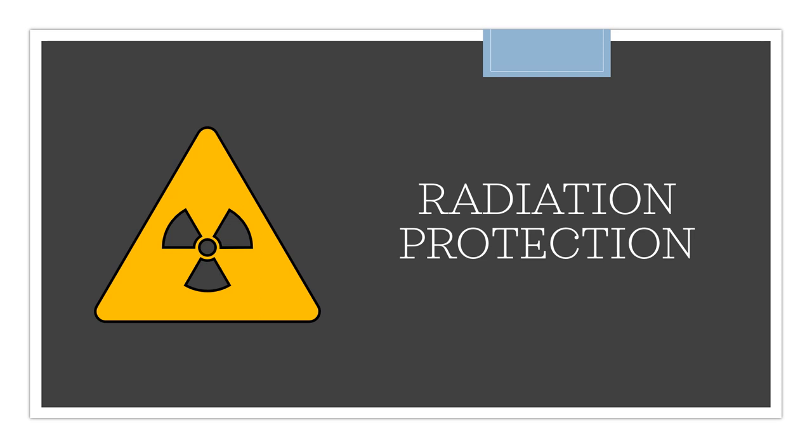Other good radiation practices include: Were radiation protection measures used for patients whose radiosensitive cells were positioned within 2 inches of the primary beam? Was the field size collimated tightly? Were exposure factors, kV, mA, and time, set to minimize patient exposure? If AEC was used, was the backup time set to prevent an overexposure to the patient? Are there anatomic artifacts demonstrated on the projection? Were personnel or family who remained in the room during the exposure given protective attire, positioned as far from the radiation source as possible, and present only when necessary for the shortest time possible?